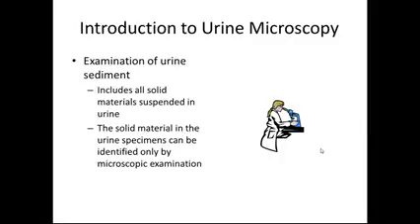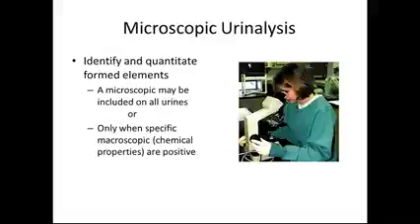Microscopic urinalysis lecture. Introduction to urine microscopy, which is the examination of the urine sediment. It includes all solid materials that are normally suspended in urine. The solid material in urine specimens can be identified only by microscopic examination.